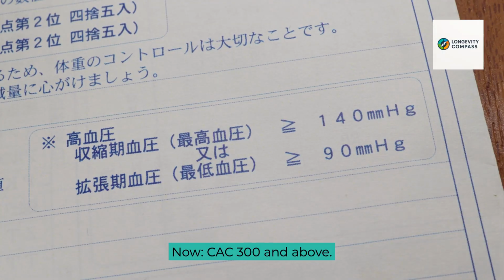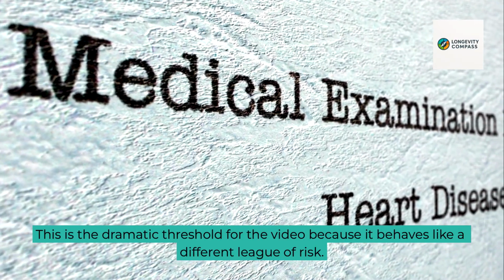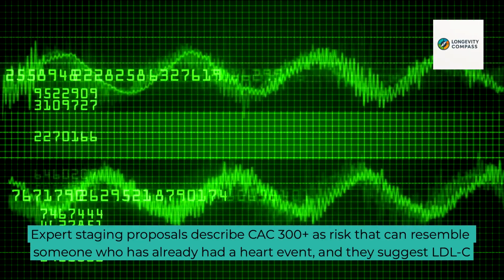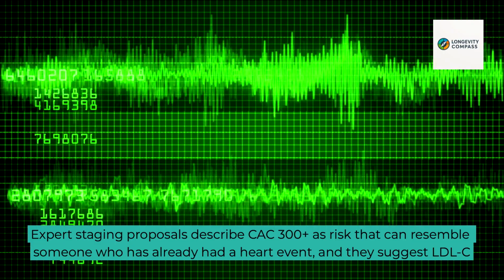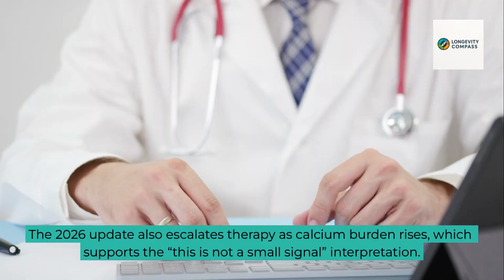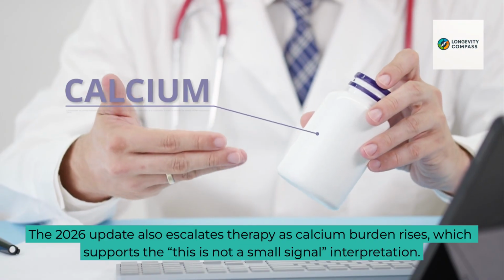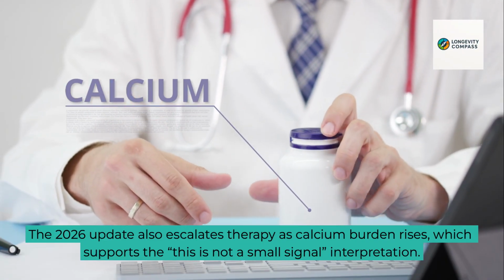Now, CAC 300 and above. This is the dramatic threshold for the video because it behaves like a different league of risk. Expert staging proposals describe CAC 300 plus as risk that can resemble someone who has already had a heart event, and they suggest LDL-C targets in the very aggressive range. The 2026 update also escalates therapy as calcium burden rises, which supports the "this is not a small signal" interpretation.